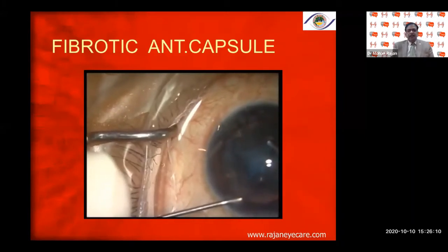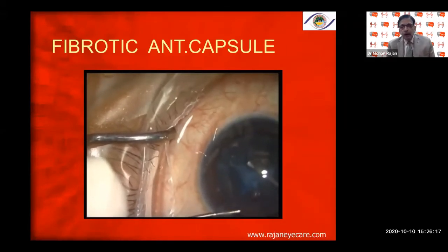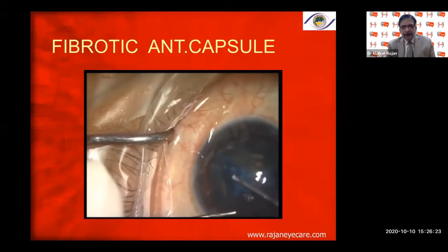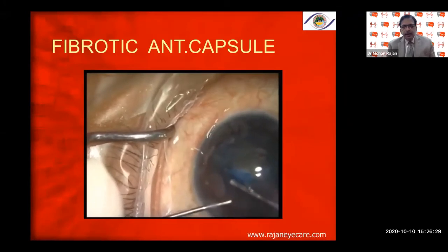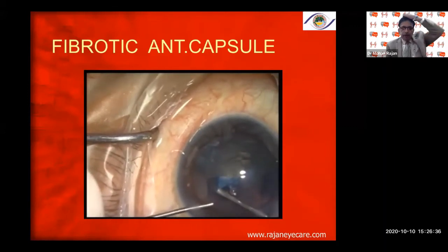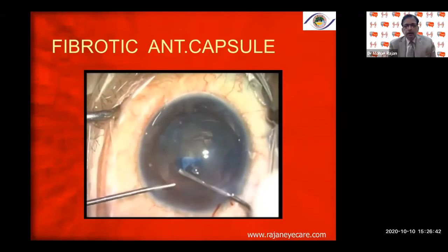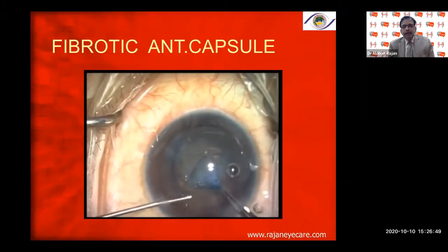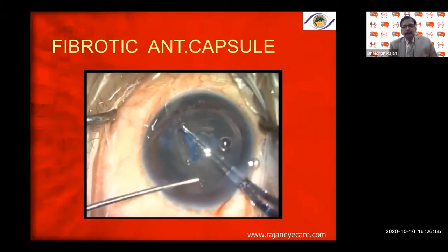In special situations like a fibrotic anterior capsule, it is sometimes very difficult to do the capsular rhexis. This is a traumatic cataract with fibrosis of the anterior capsule — you can see the anterior subcapsular fibrosis. Always go outside the fibrotic area so that you can include the fibrotic area within the capsular rhexis. You can see how I try to do that — going external to the fibrotic area, then completing the entire rhexis starting with the needle.